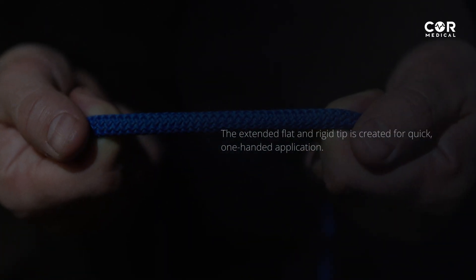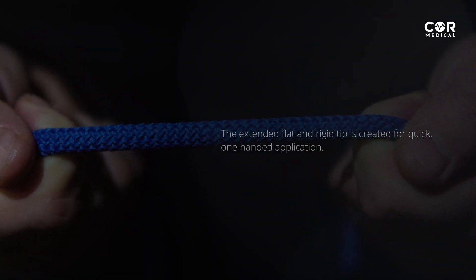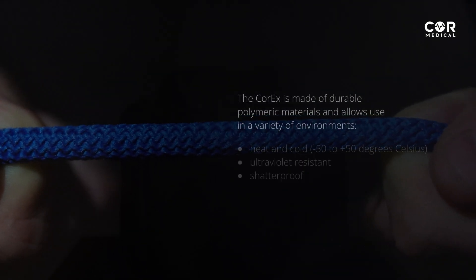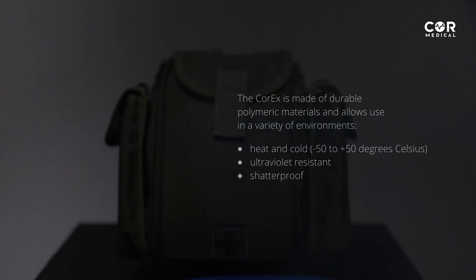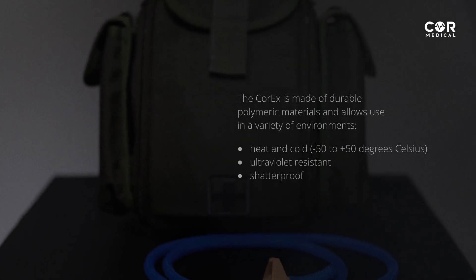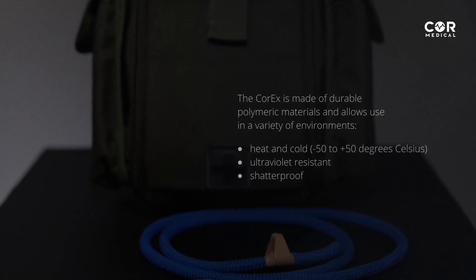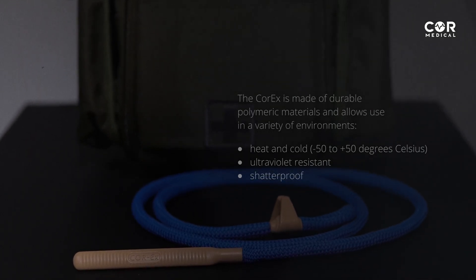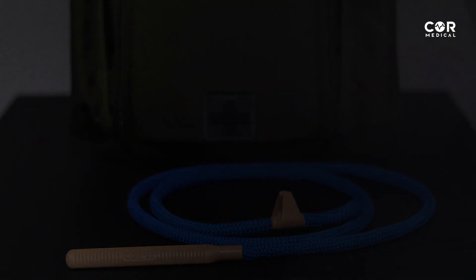The extended flat and rigid tip is created for quick one-handed application. The Core-X is made of durable polymeric materials and allows use in a variety of environments — heat and cold, from minus 50 to plus 50 degrees Celsius. Core-X is also ultraviolet resistant and shatterproof.